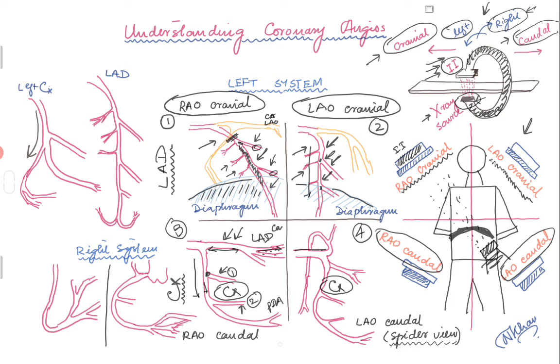Image 4 is the LAO caudal view, also known as the spider view. The spider view is very good for looking at the left main and nicely opens up the bifurcation. If you have ostial LAD or ostial circumflex disease, this is the best view. The diagonals are around the two o'clock position, the LAD goes away from you, and the circumflex comes down. When performing the spider view, we focus primarily on the left main, ostial LAD, and ostial circumflex.